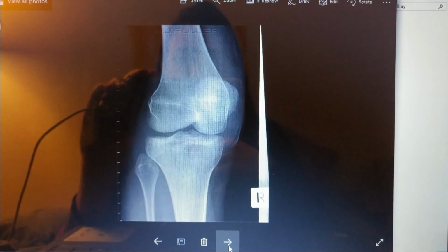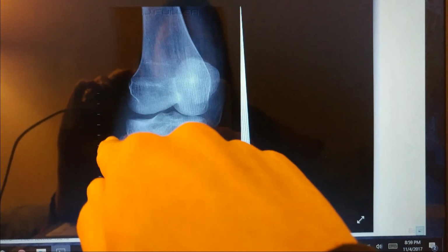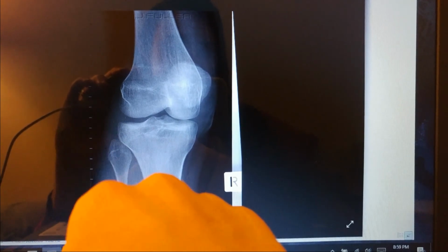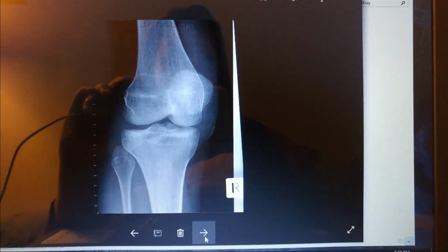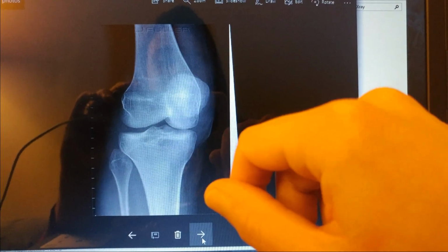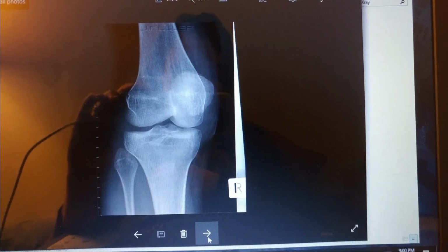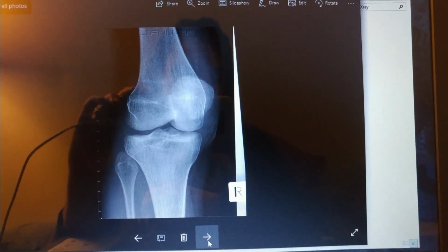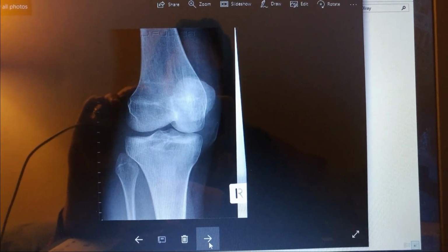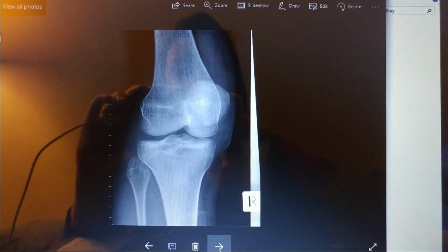So for this one, the main thing for the oblique projection medially is that the tibia and the fibula are separated at their proximal articulation. The patella for the medial rotation is projected kind of off to the medial condyle, and vice versa for the lateral rotation one. That's about it. So we'll go on to the next image.